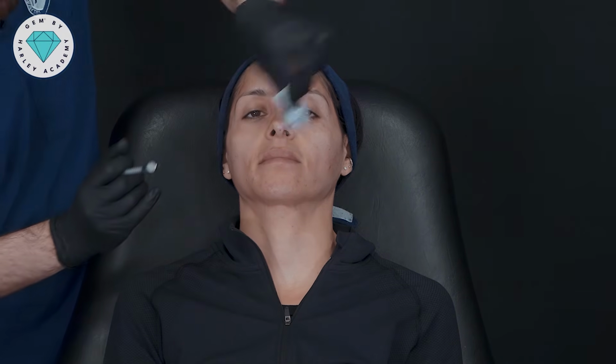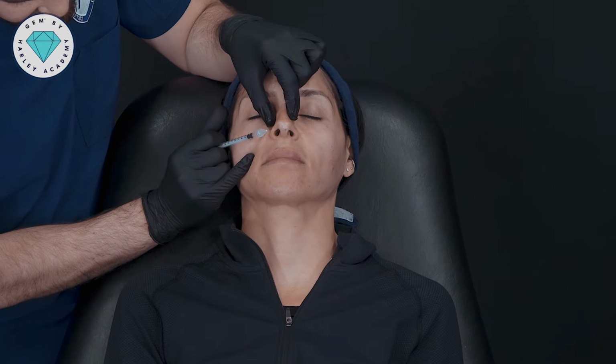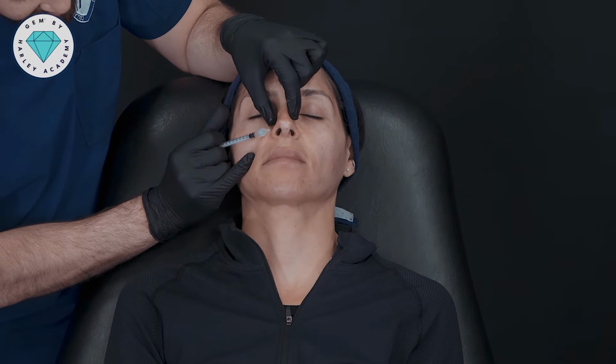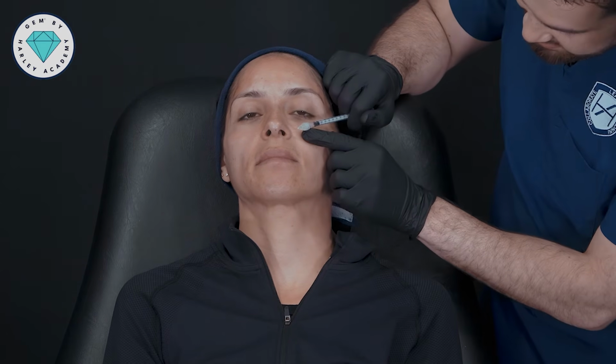And for reducing the flaring to the alar, we're going to do a little intradermal couple of units, which the patient will subtly recognize as it kicks in over the following days. These are very small muscles involved, so we only need 1 to 2 units.